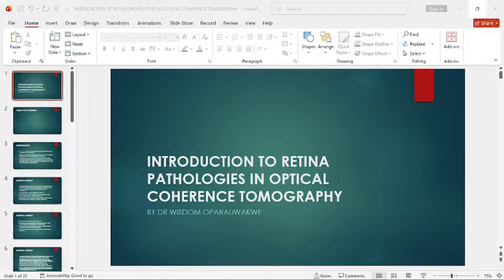I think we are ready to start. So today we are looking at introduction to retinal pathologies in optical coherence tomography.